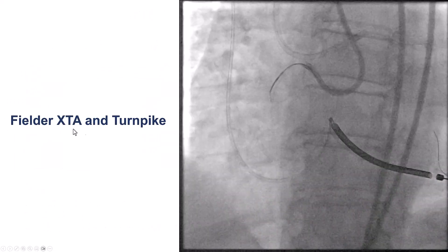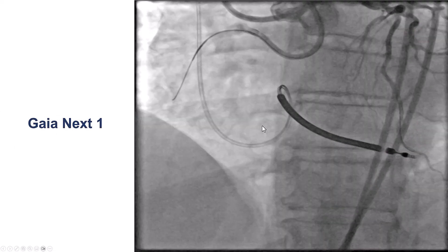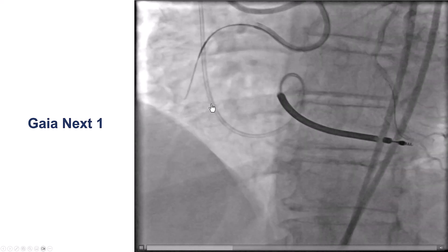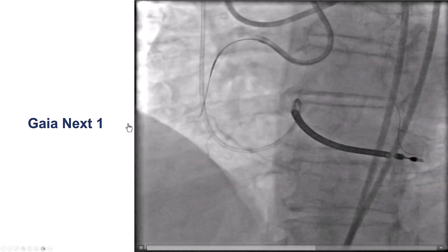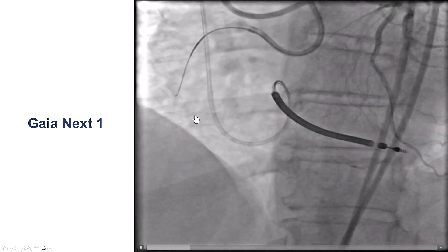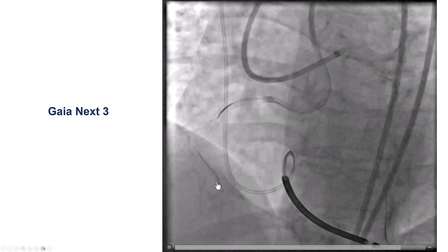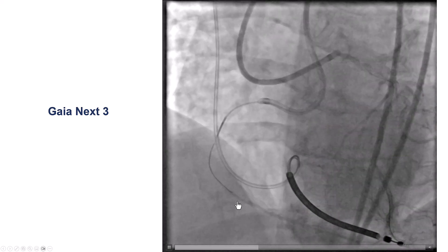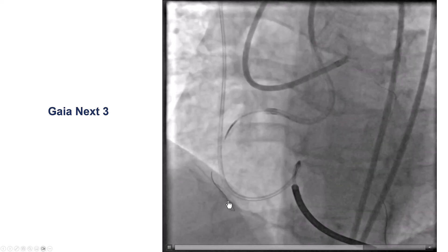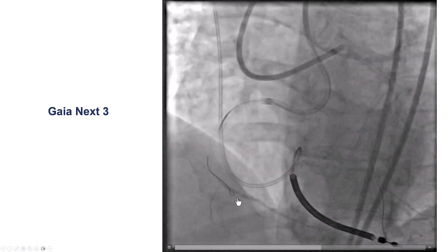We tried with a Fielder XTA through a Turnpike microcatheter, but had difficulty getting through the proximal cap. We switched to a more penetrating Gaia NX1, which seemed to be going into an acute marginal branch. We then switched to a Gaia NX3, which did seem to go along the course of the vessel. However, it became clear from the knuckling of the distal part of the wire that we were not in the lumen but in the extraplaque space.